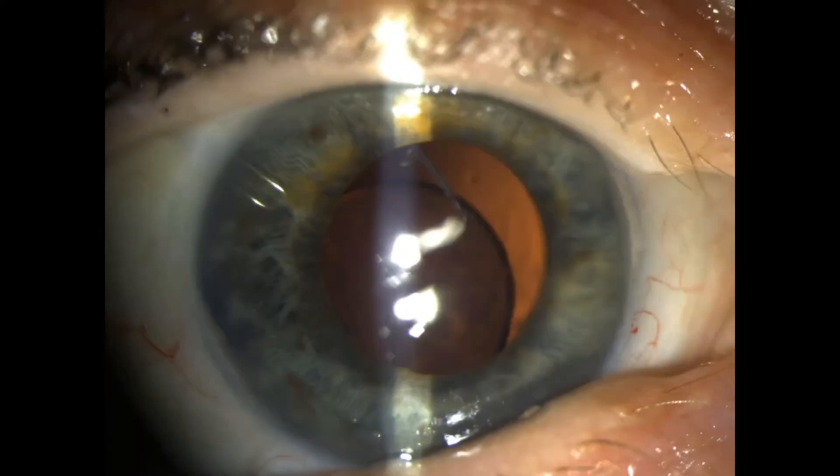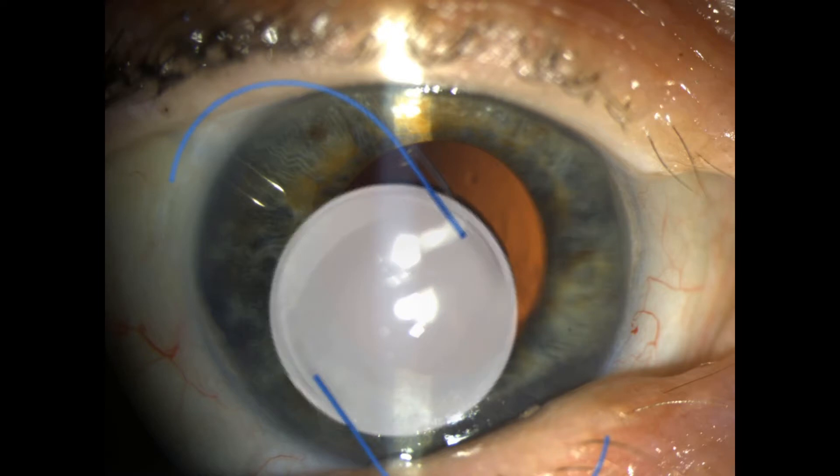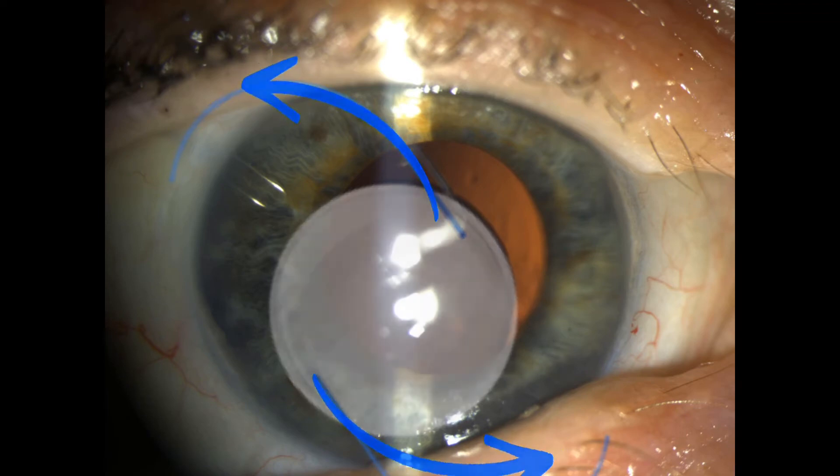You can literally see the lens implant shaking inside the eye as the patient blinks. Let's freeze frame that image to show you each part. The central lens optic is surrounded by two blue haptics made out of prolene that help to hold the lens in place.